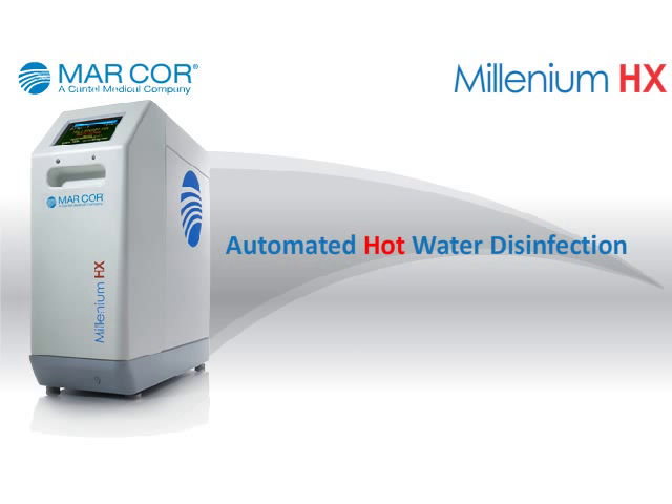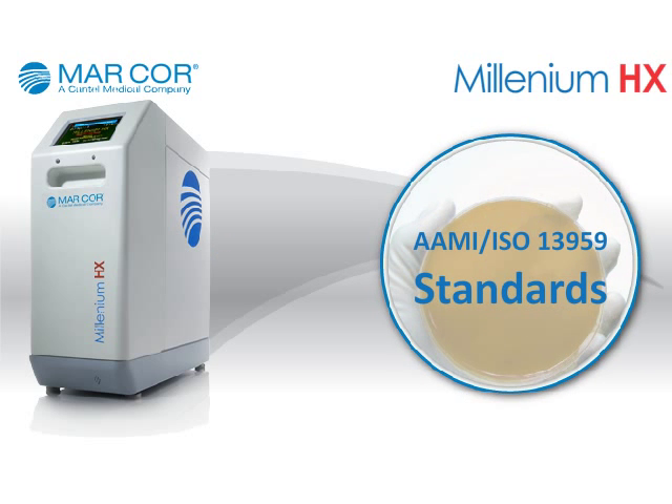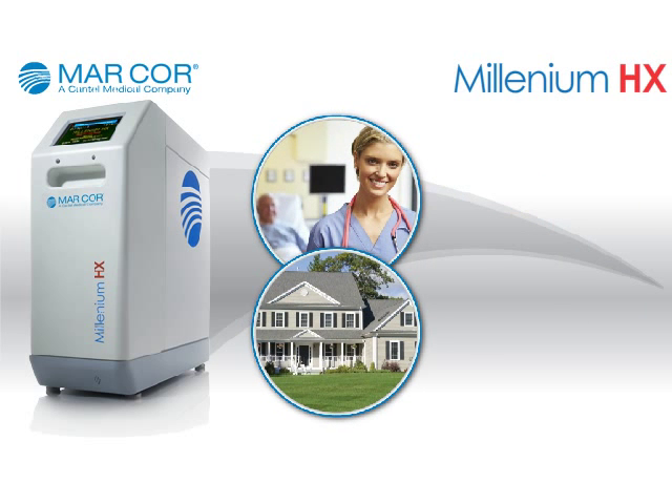The Millennium HX features automated hot water disinfection capability, is designed to meet current AAMI ISO 13959 water quality standards, and is FDA cleared for use in acute and home dialysis settings.